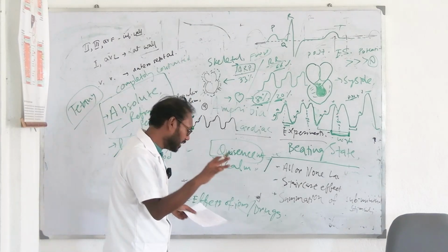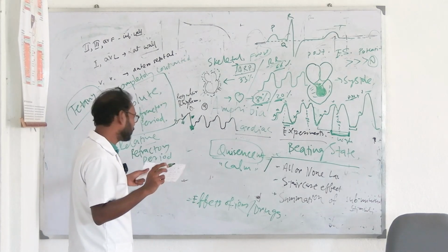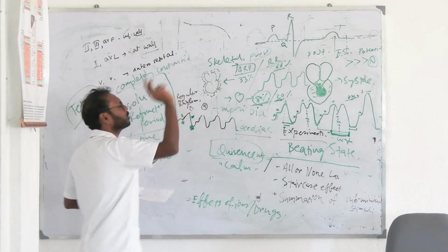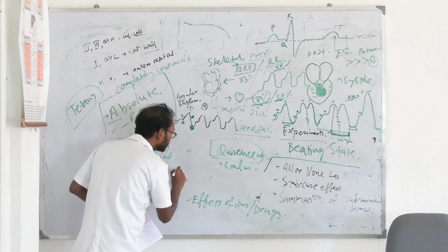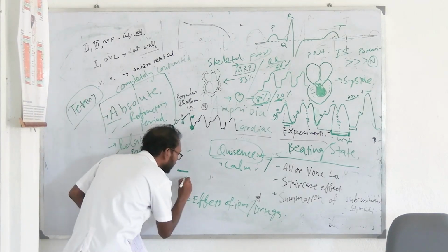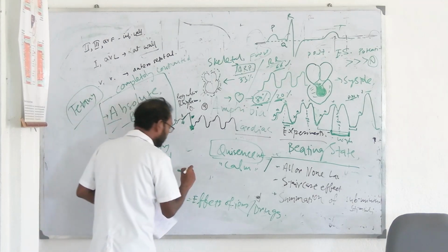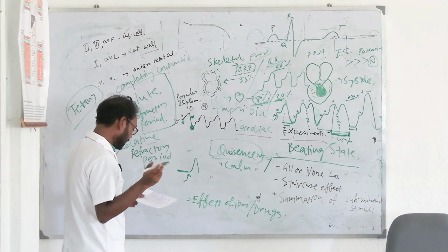A heart that is not beating, we will be providing stimuli continuously at various points from that electrical circuit we put. So what will we get? First, the heart is dead. There is no beating. The heart is calm. The heart is quiescent. It will appear like this. Then we put the stimuli. Here we are putting one stimulus. What will happen to the heart? The heart will beat, like this.